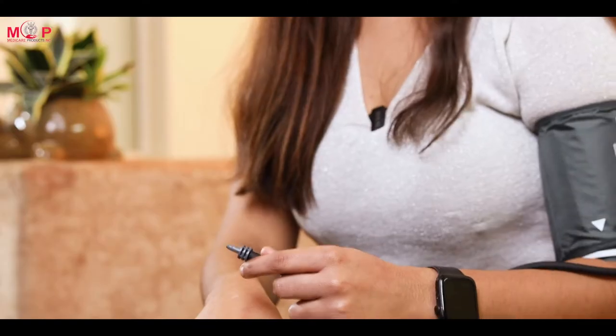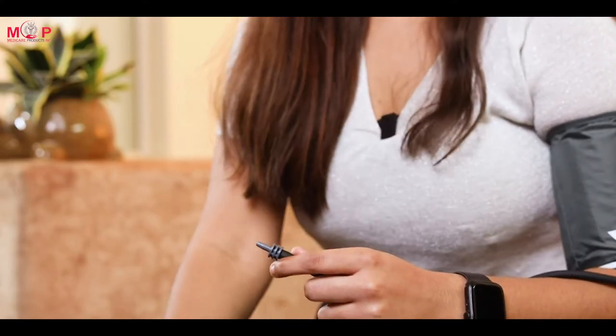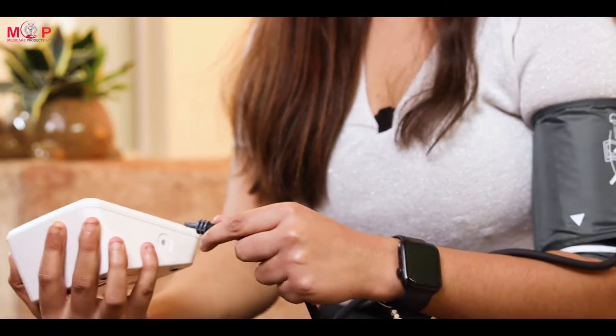Now wrap the cuff around your arm two inches above the elbow. Connect the other end of the tube to the BP monitor. To measure your blood pressure, sit comfortably on a chair, put your hand forward towards the table, and start the machine.